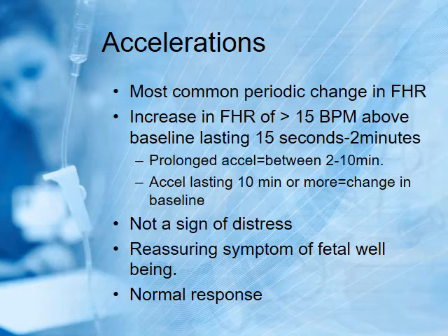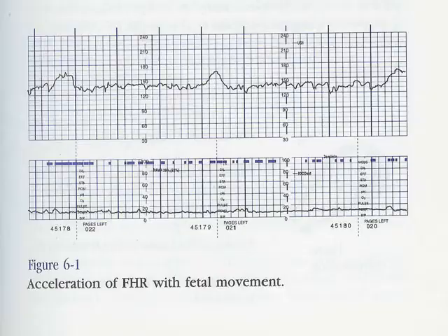Accelerations are not a sign of distress. They are a very reassuring symptom of fetal well-being and are a very normal response. So accelerations are always good. Always, always, always. Okay? Remember, it has to meet the criteria of increasing 15 beats per minute above the baseline and last long enough to be called an acceleration.